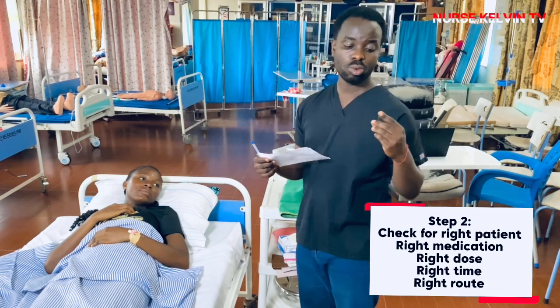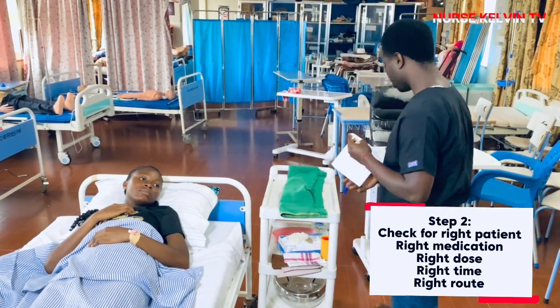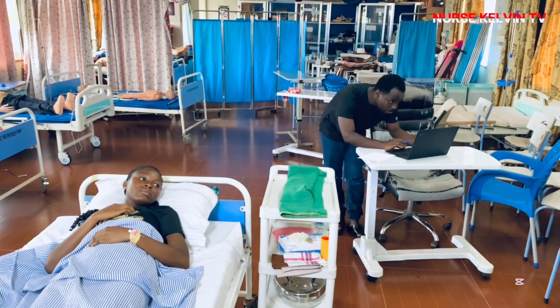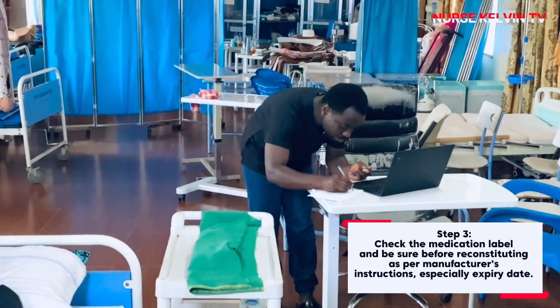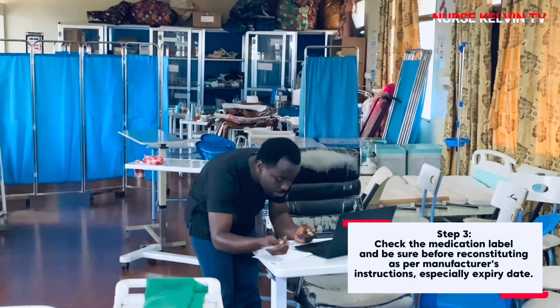So this is the ampoule. You will check it against the chart. So ampoule furosemide 40 milligram.